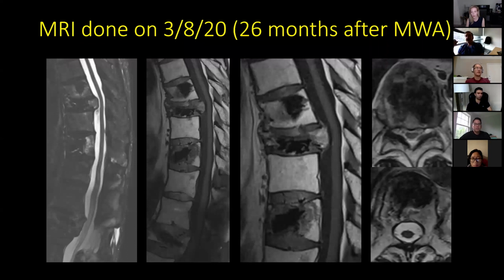Yeah, and you'll see some evidence of treatment response at the 4-week mark. At least I get an idea: if I had an ablation zone of say 2.5 by 2.5 centimeters, I get a good idea at that time point whether I did achieve that or not. Was there under-ablation or over-ablation? And I'll allude to that also in a little bit, when we get to the ablation part.